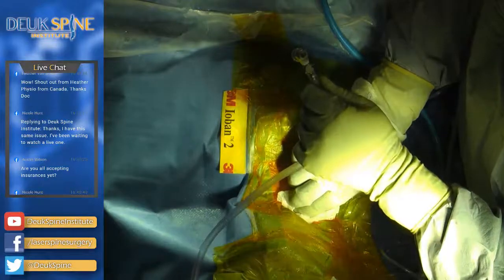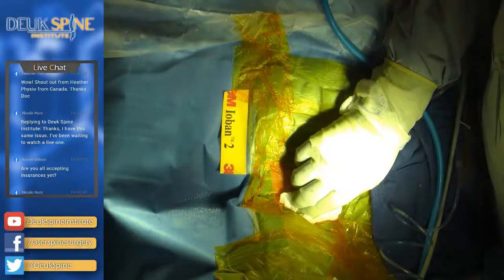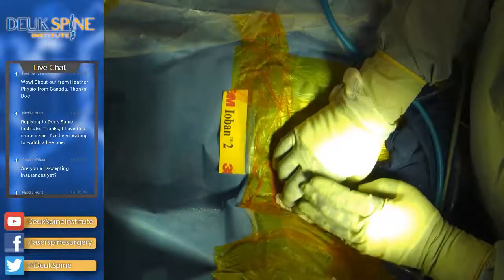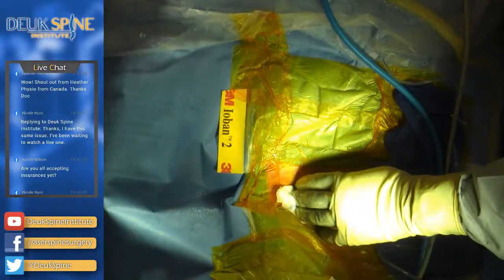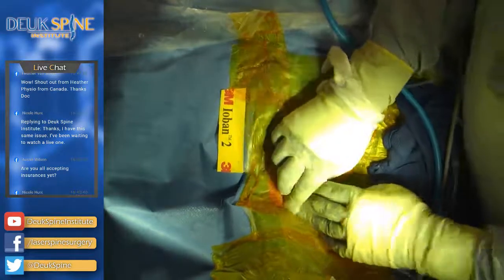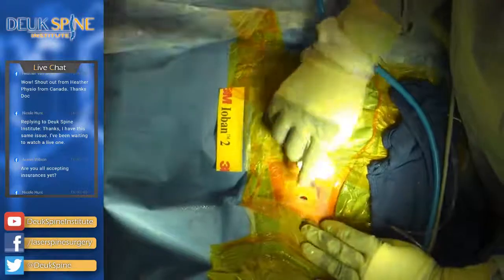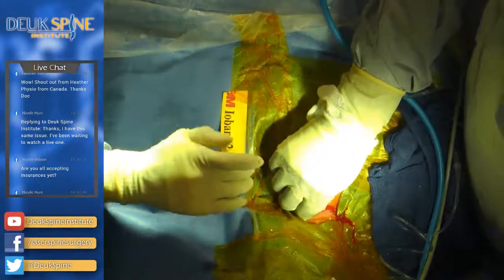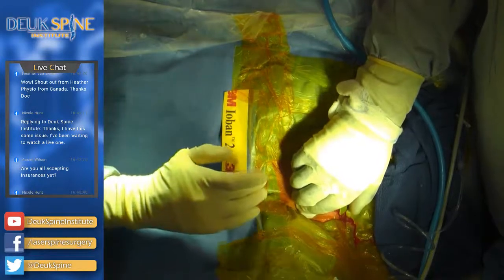Okay. Now, the problem is this is a difficult surgery to learn how to do, and if you're not trained properly, you'll hurt somebody badly. Fortunately, I learned good technique, and I've never had a complication in any of my endoscopic laser surgeries now in 15 years. So 0 complications. We're done. You can see the incision right there. He's got a little vein bleeding. So we're just going to hold some pressure for a little bit. It's probably external jugular.